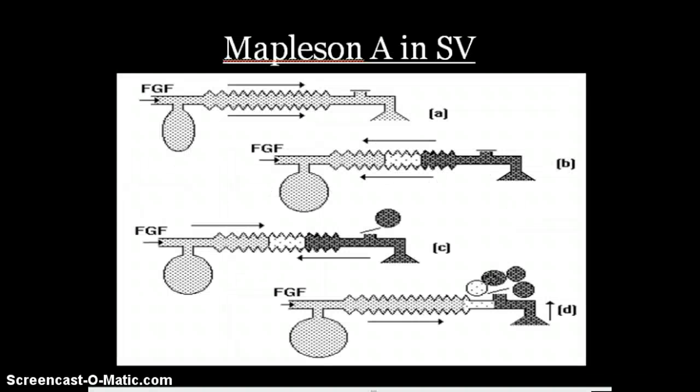During spontaneous ventilation, the system is filled with fresh gas before connecting to the patient. Upon inspiration, the fresh gas from the machine and the reservoir bag flows to the patient, collapsing the reservoir bag. On expiration, fresh gas continues to flow into the system, filling the reservoir bag. The expired gas, consisting partly of dead space gas, pushes the fresh gas from the corrugated tubing into the reservoir bag and collects inside the corrugated tubing.